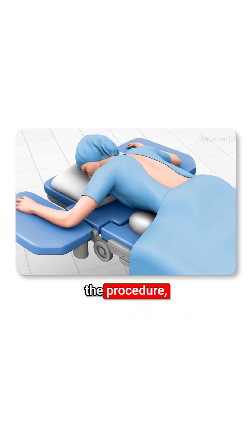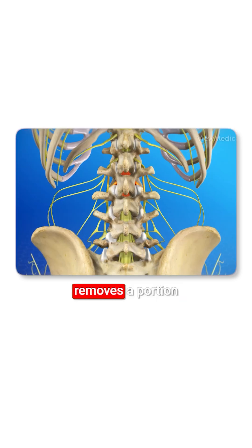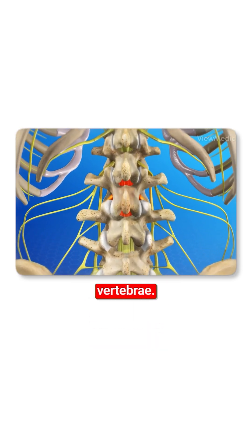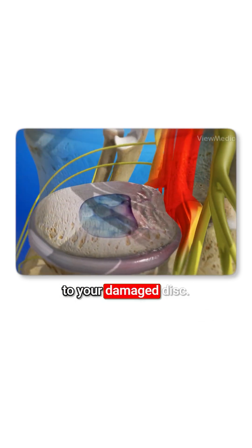In preparation for the procedure, you are anesthetized and positioned face down. The surgeon makes an incision in your lower back. The surgeon removes a portion of bone called the lamina from the rear of one of your vertebrae, creating a window that allows access to your damaged disc.